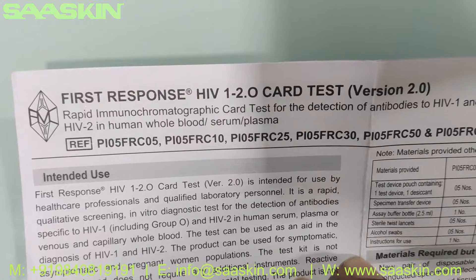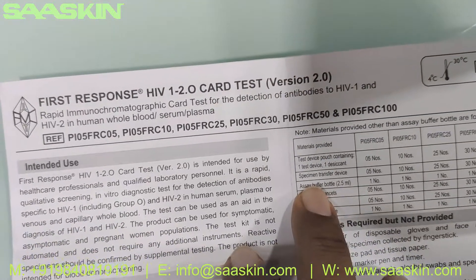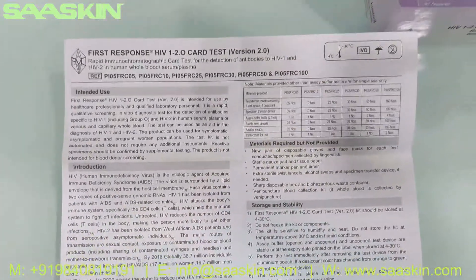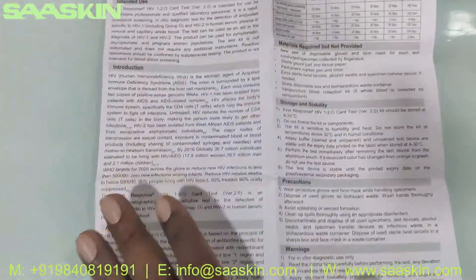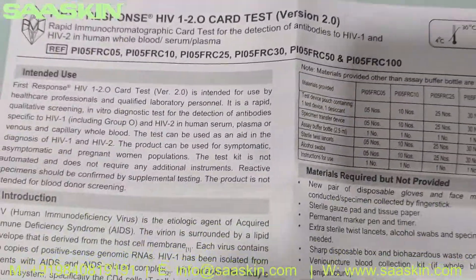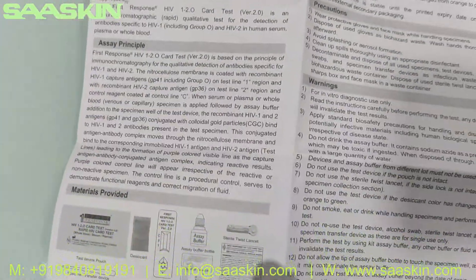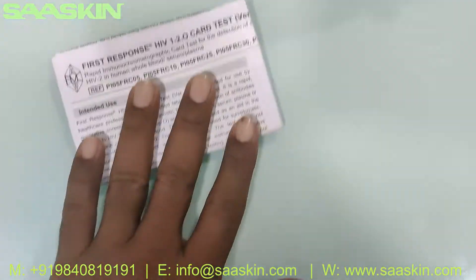This is the First Response HIV 1 and 2 card test. Basically this is a rapid immunochromatographic card test for the detection of antibodies to HIV 1 and HIV 2 in human whole blood, serum, or plasma. You can see the complete instruction manual — it covers the sampling procedure, test procedures, and how to interpret your results.